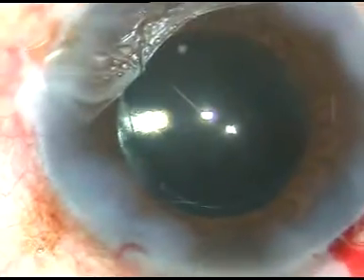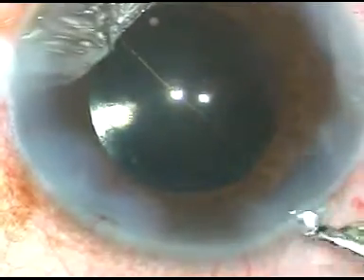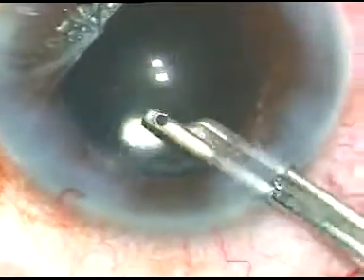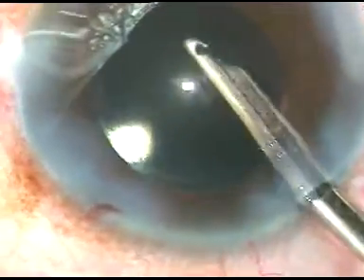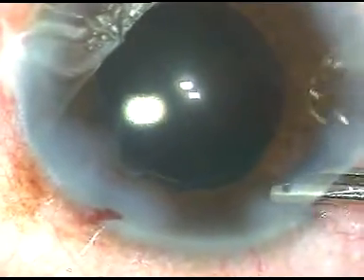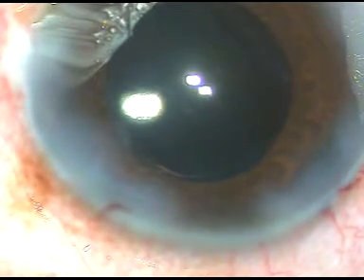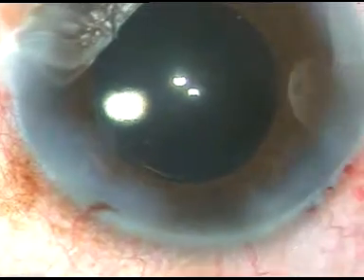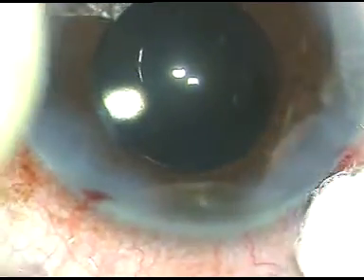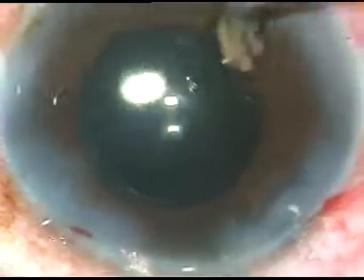I just hydrate the side ports now, inject a little bit of moxifloxacin, and give this final wash. This final wash is very important — I believe strongly that this final wash with good quality BSS will cause no toxic anterior segment syndrome in your patients. Thank you very much for your eagerness to watch these videos. I strongly believe that these videos will help you in developing your surgical skills, and with a lot of sincerity, you can be one of the best phaco surgeons in the world.